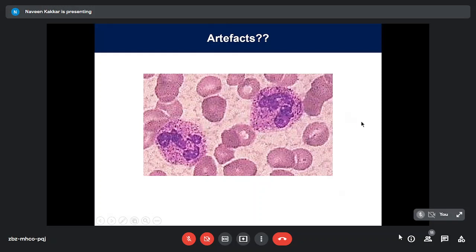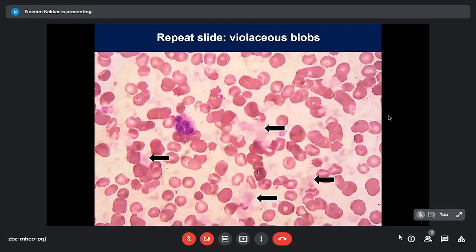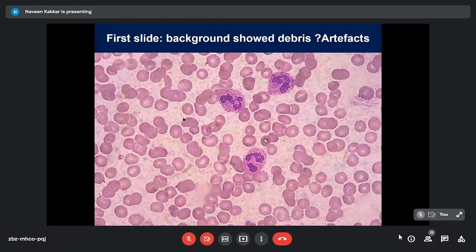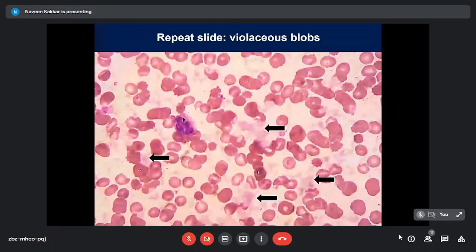So just as a stroke of luck, I said, okay, let's make another slide and have a look before I go. And the next slide showed a very different picture. None of those artifacts, but you could now pick up these violaceous blobs in the plasma area or the background area. So not in the RBCs, nothing on the neutrophils. If I go back to the first slide, it's nothing compared to what we saw now. Very, very different picture suddenly.